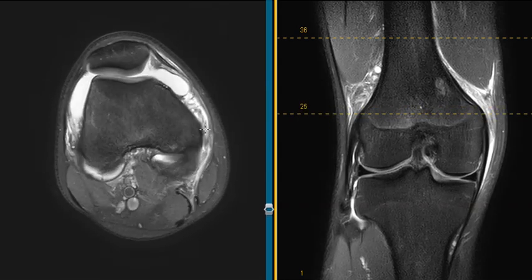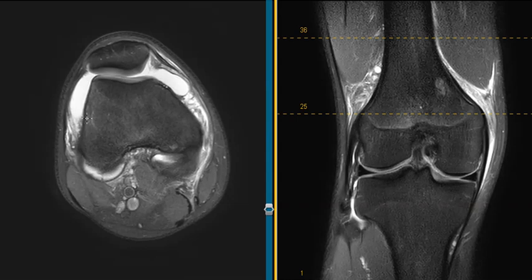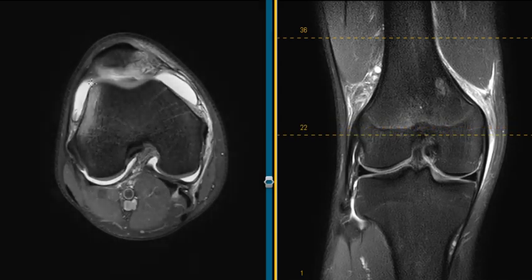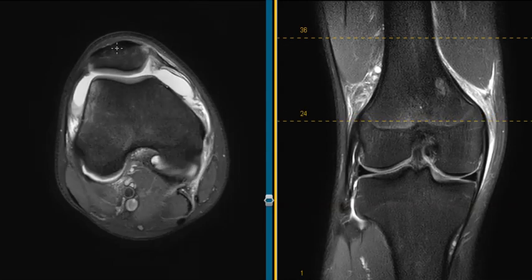So it looks like a transient patellar dislocation. Once it comes back and pops back to normal position, often the kneecap will be positioned laterally because this structure is torn, but in this patient it came right back to the neutral position. These patients almost always have an injury of the femur, and sometimes the kneecap. This patient does have a subtle injury of the kneecap and some of the ligament attachments along the bottom. They also have brightness in the femur — this is a typical bone bruise. So the kneecap went way over, hit, and popped right back to normal position.